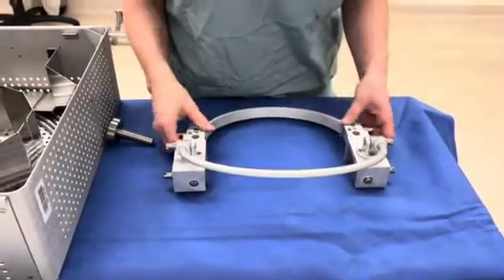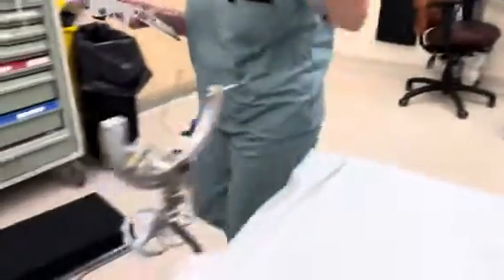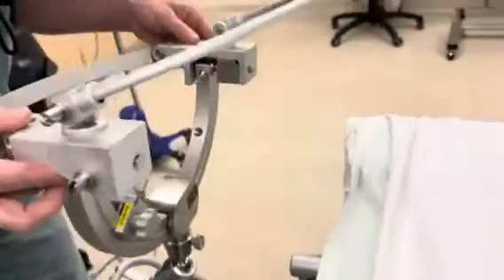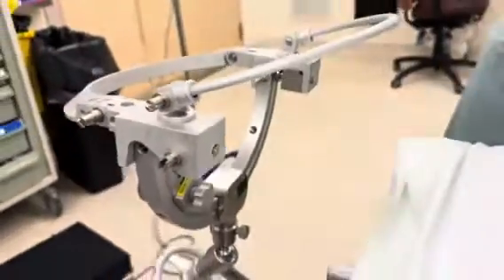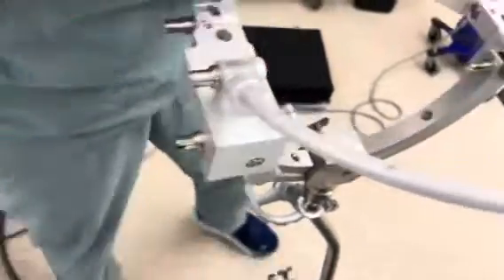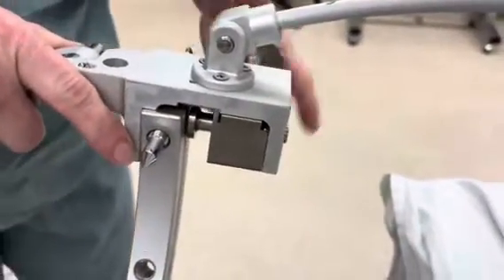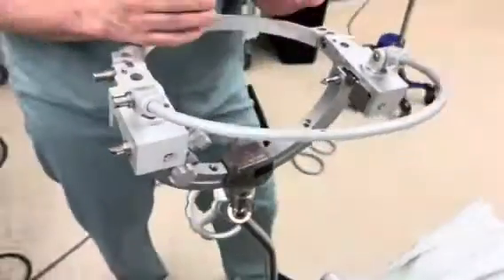I'm going to show you what it looks like on the frame. Imagine we're all sterile now and the patient's head is here. What the surgeon is going to do is grab it and put it here, then take the wrench and tighten that up. Once it's nice and tight, the surgeon can operate by putting his hands on it.